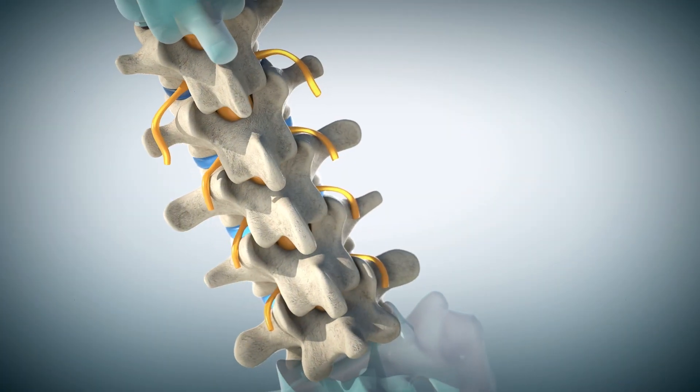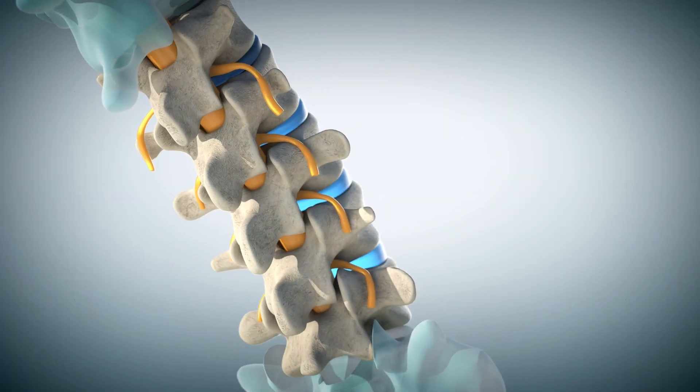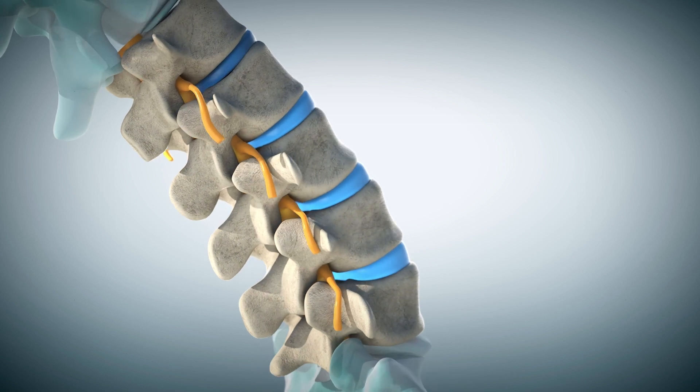This advanced technique allows us to treat certain conditions of the lumbar spine with smaller incisions and less disruption to the surrounding tissues. The lumbar spine, or lower back, is a complex structure consisting of bones, discs, nerves, and soft tissues.